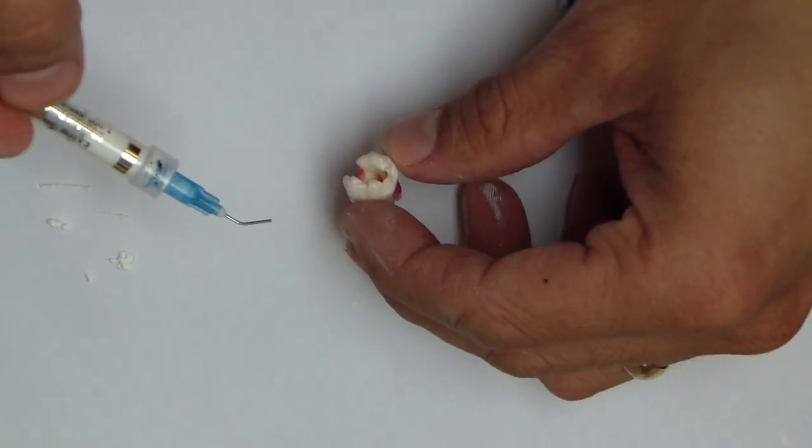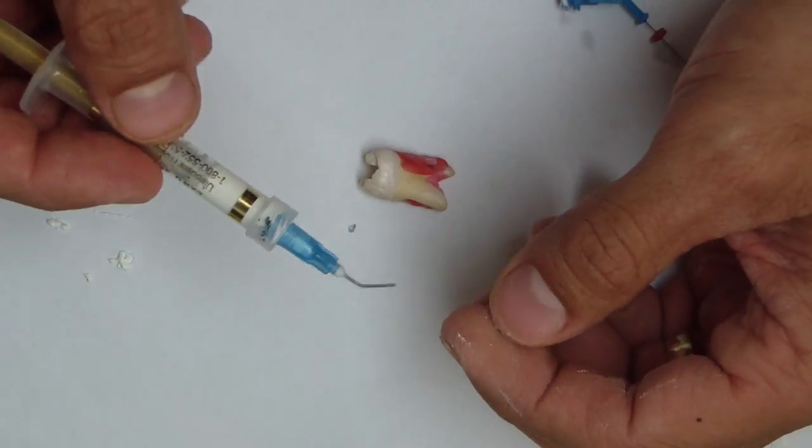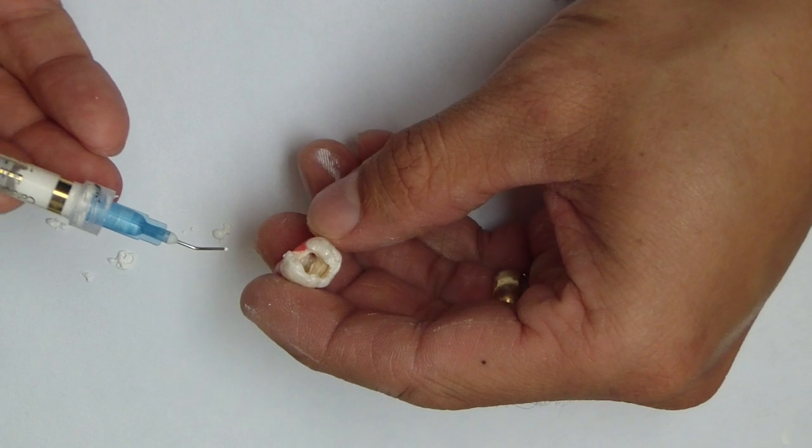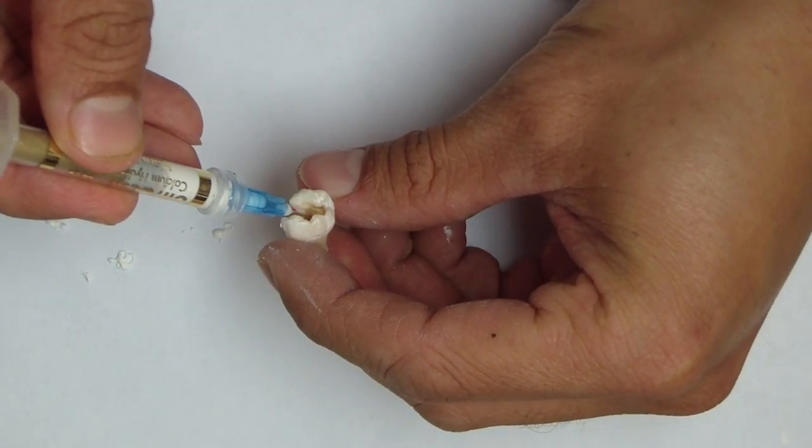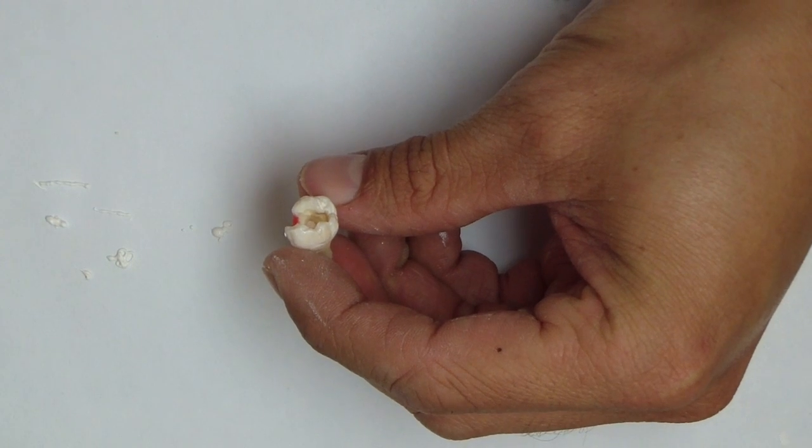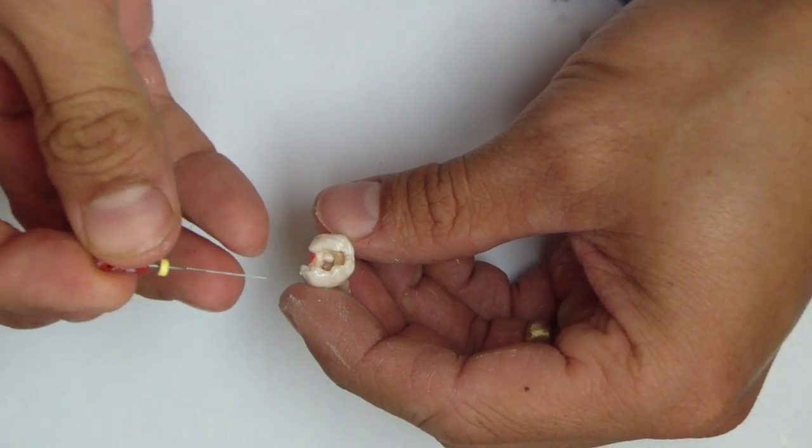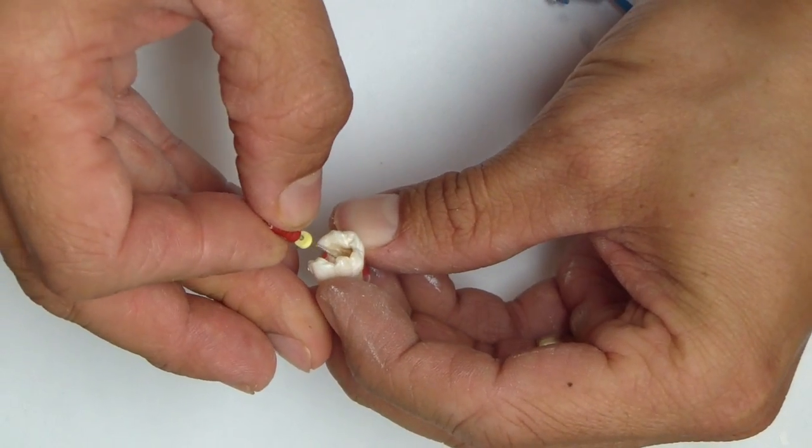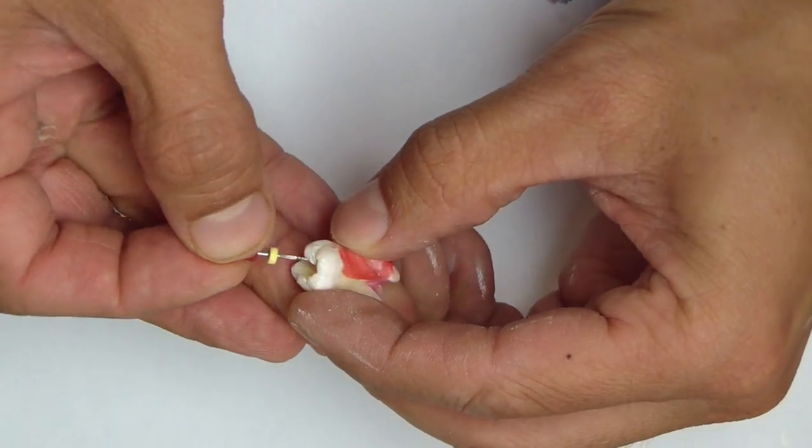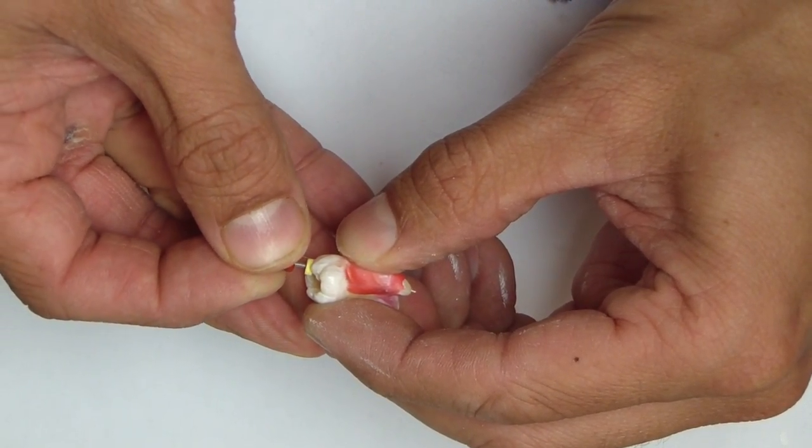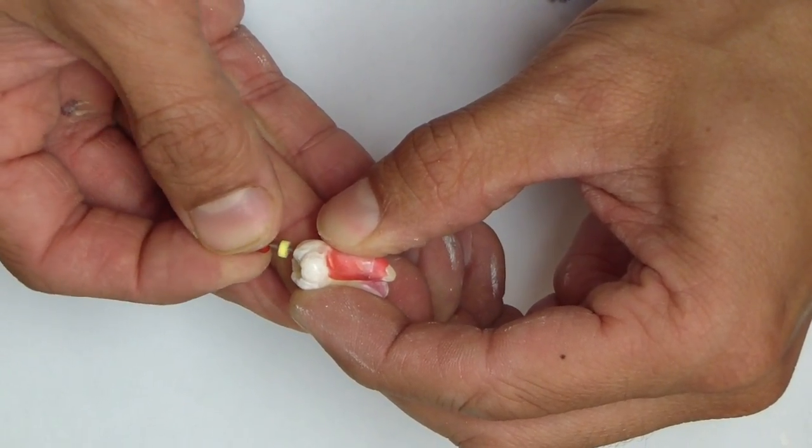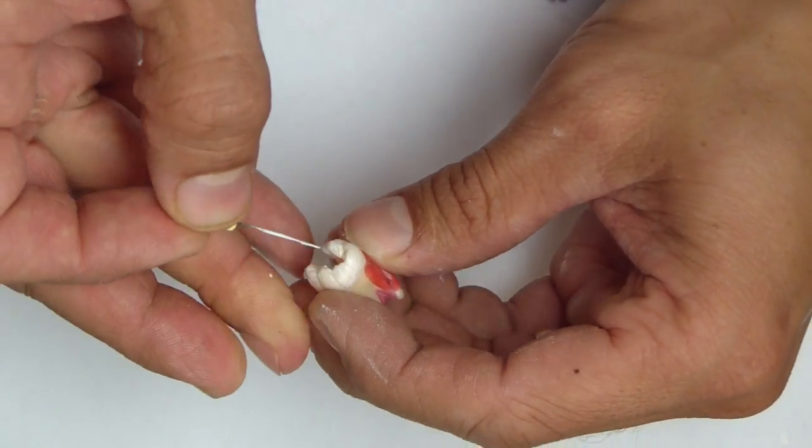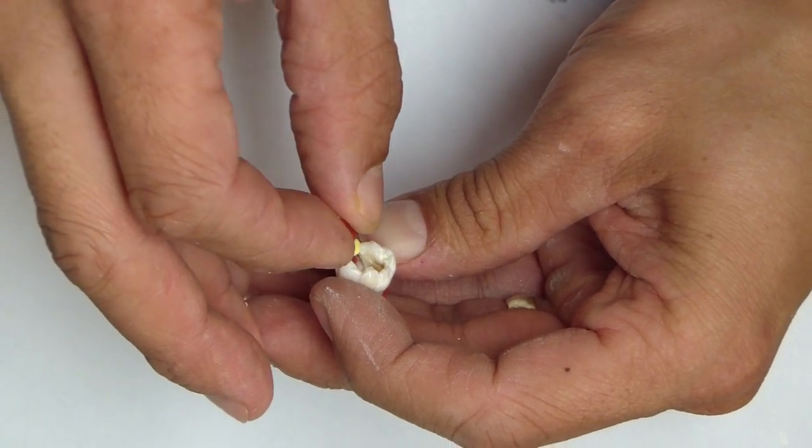This is what I used to do: I'd take my Ultracal or whatever calcium hydroxide material you're using, place a little at the orifice—because I had nothing else and didn't know any better—and I would take a K-file after I've instrumented the canals, go to my working length and sort of mix it in there, just looking to get a decent coating of the entire canal. I'm trying to prevent getting that file out the apex. So I've coated the walls—that's one way of doing it.